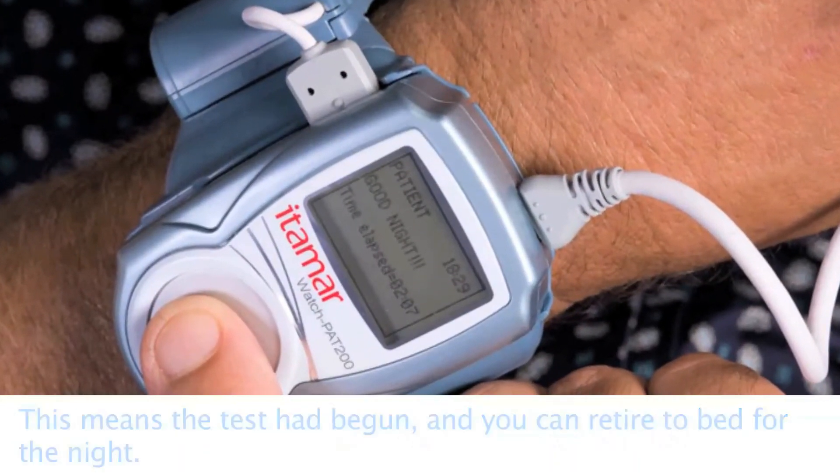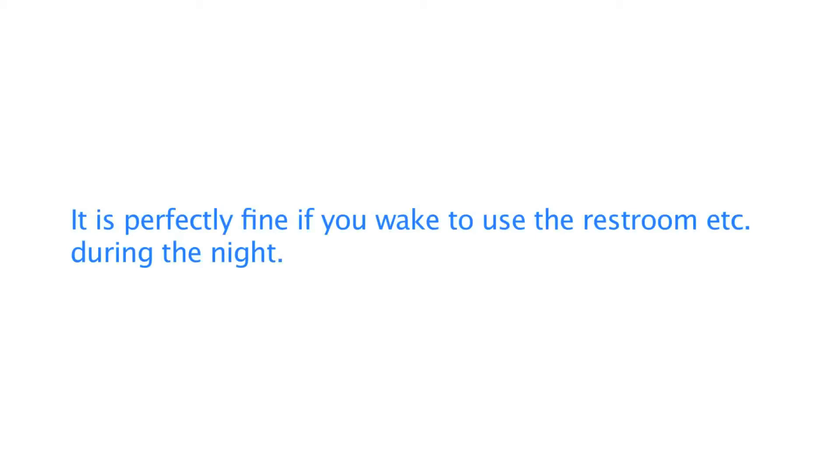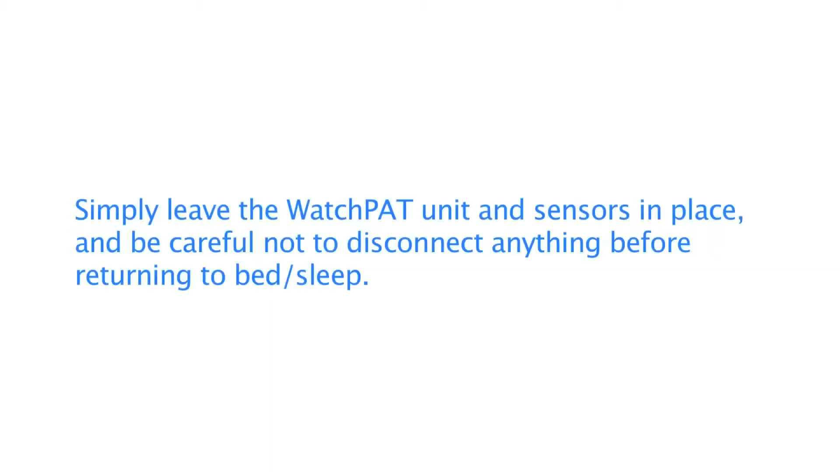After about 30 seconds, the unit will read "good night." This means the test has begun and you can retire to bed. It's perfectly fine if you wake to use the restroom during the night — simply leave the WatchPat unit and sensors in place.